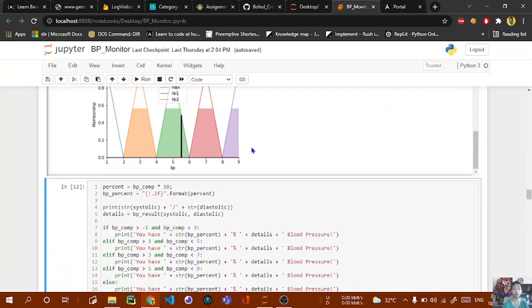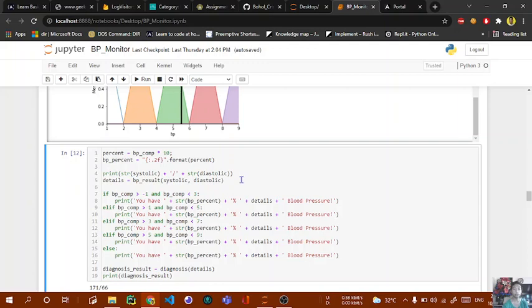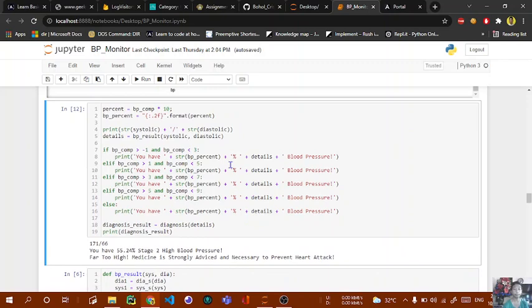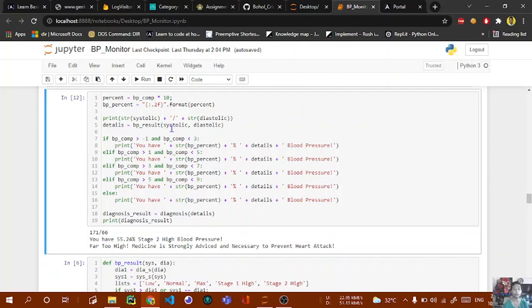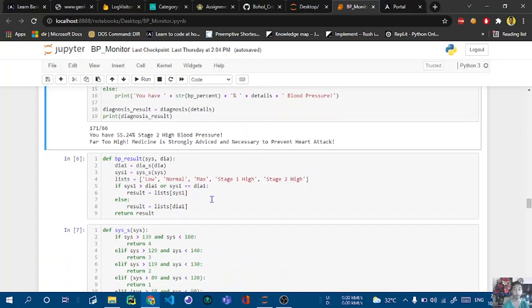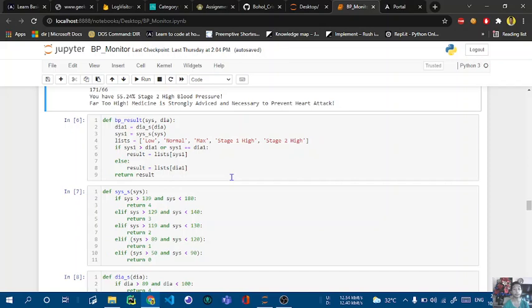So in order for us to know what we should do when we receive that result, in my case, I just multiplied it by 10, so that I can show that you have 50% instead of 5 out of 10. Then I called BP result. The computed BP is just a percentage, but I added an additional function so that you can check what type of category you have. If you have low, or high blood pressure 1, we call BP result. Here we also need to call the diastolic and systolic functions.